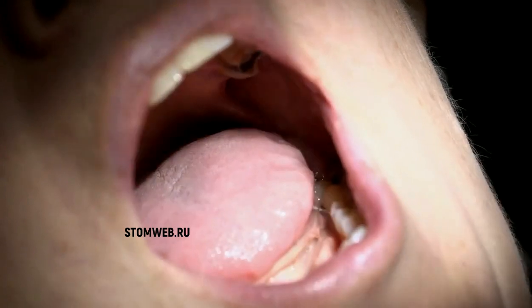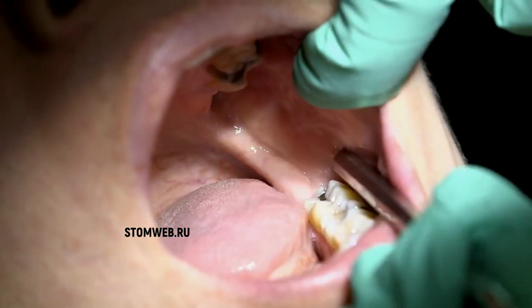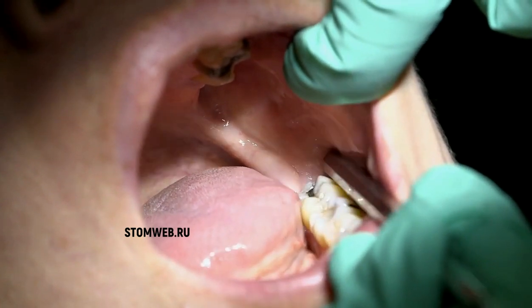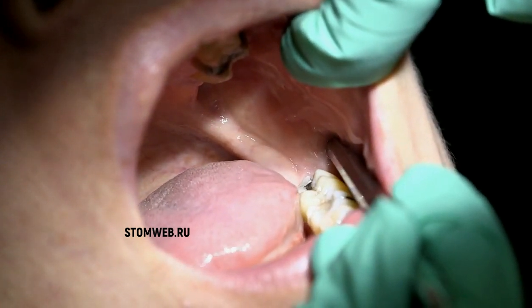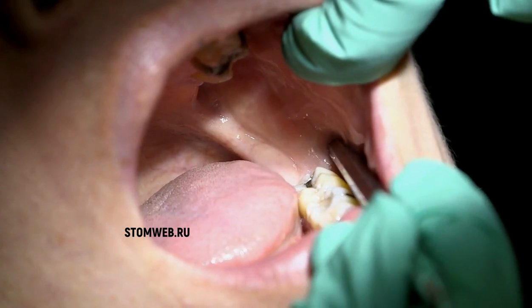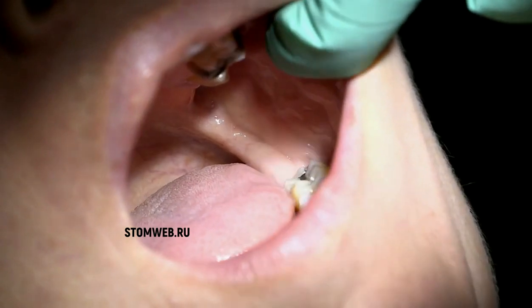We will now perform a long buccal block in quadrant 3. First, we need to identify the target bony site, which is the anterior border of the ramus, and the soft tissue landmark, which is the mucous membrane distal and buccal to the last molar in the arch. The barrel of the syringe should be parallel to the occlusal plane on the side of the injection.